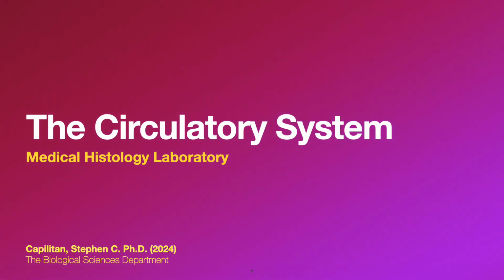This is Sir Steven, and for today we will be talking about the circulatory system as a part of your medical histology laboratory. This system comprises your heart, your cardiac valves, your cardiac conduction system, your arteries, your capillaries, your veins, and your lymphatics. Let's start with your heart.